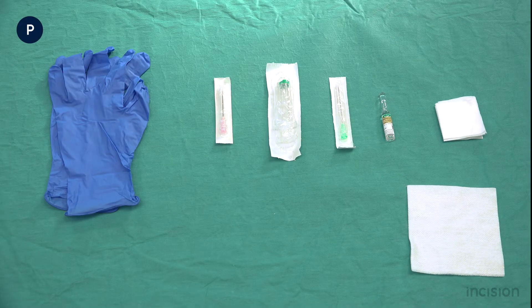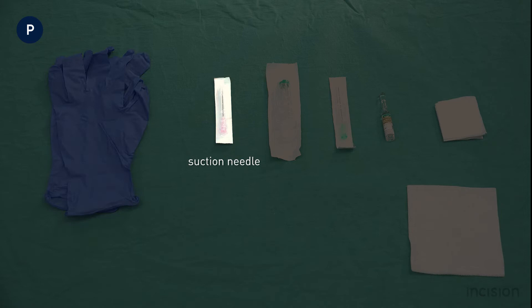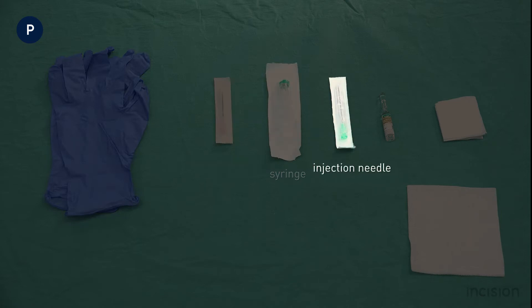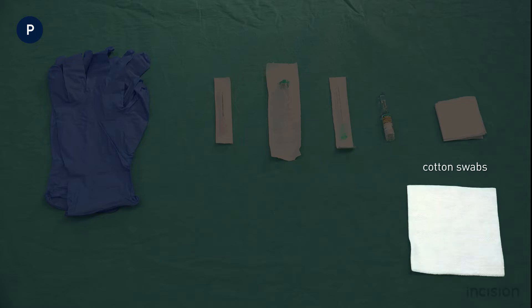The following materials are prepared: non-sterile gloves, a suction needle to draw up the medication, a syringe, a needle for injection, the required medication for injection, and alcohol cotton swabs.